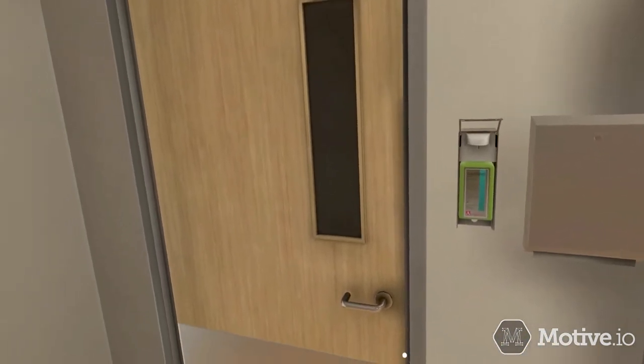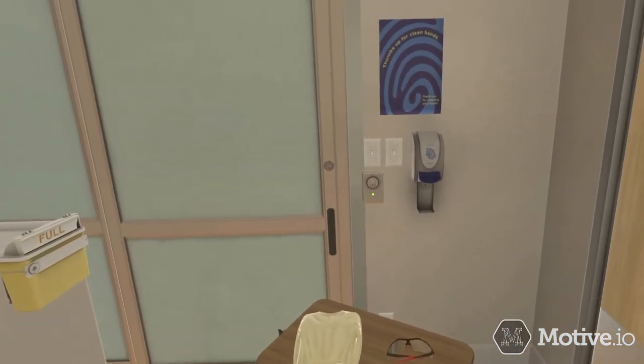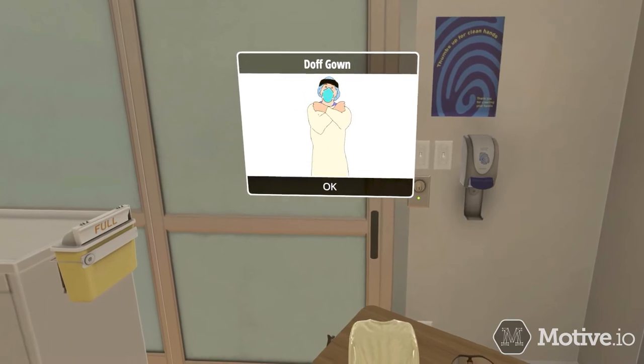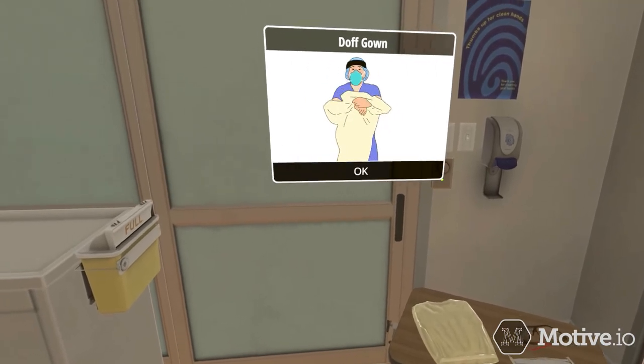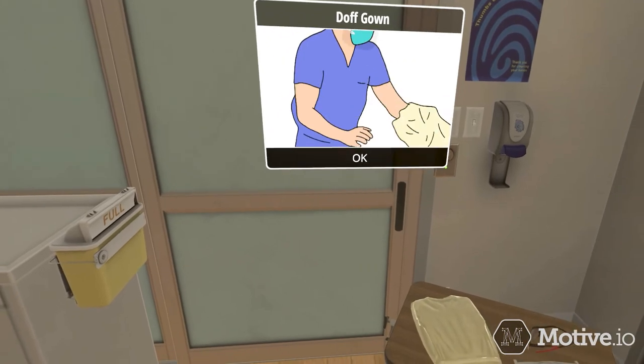Next, remove your gown. Pull the gown from the shoulders and waist, pulling it away from your body slowly and carefully, turning the gown inside out and rolling it into a ball. Discard.